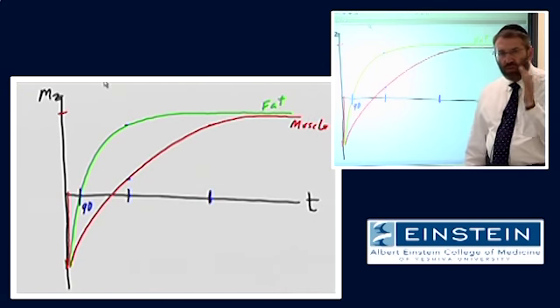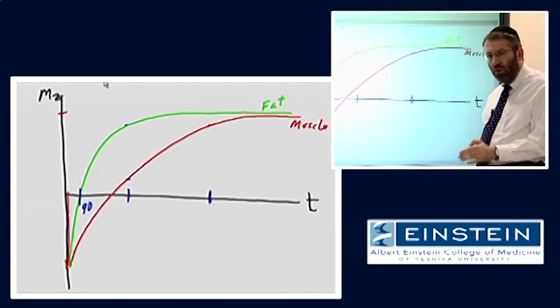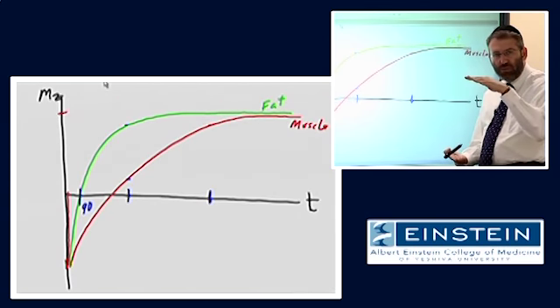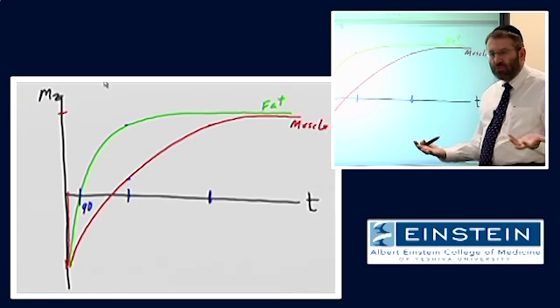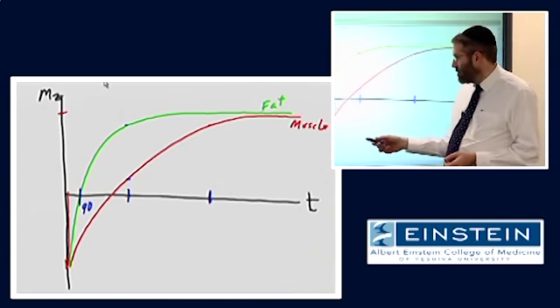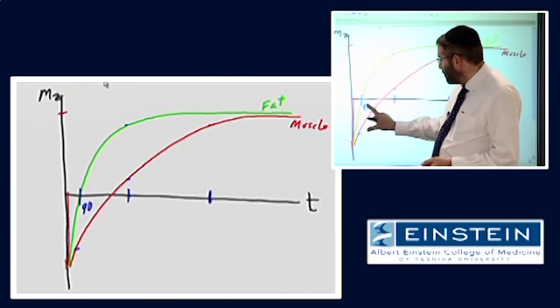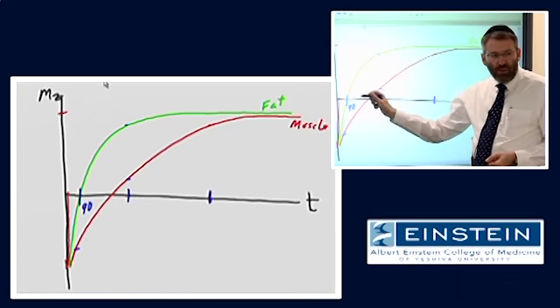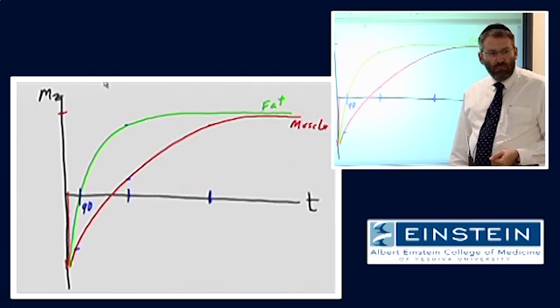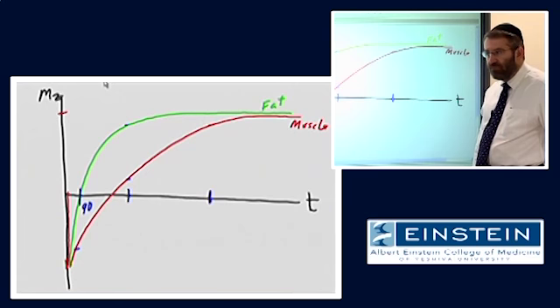At the time that we turn on our 90, we turn on the RF, it generates signal only from things that have longitudinal magnetization. In the absence of longitudinal magnetization, no signal can be made. So this image would then have contrast, which is a function of the longitudinal magnetization from muscle and the fact that we have no signal from fat. This would essentially be a fat-suppressed image.